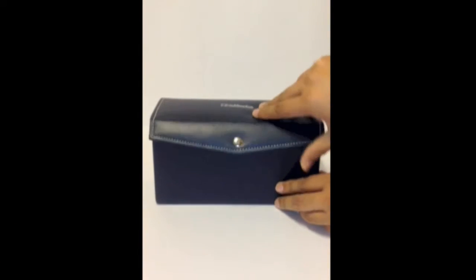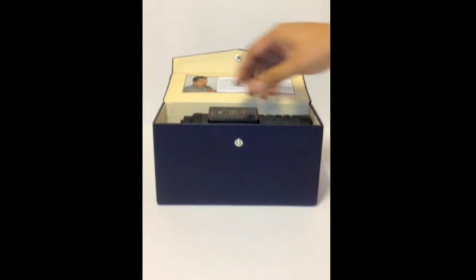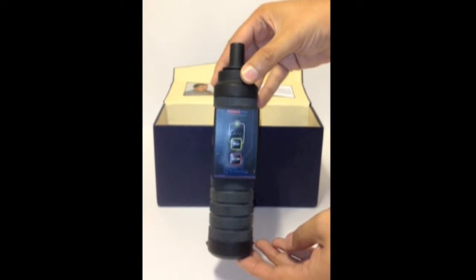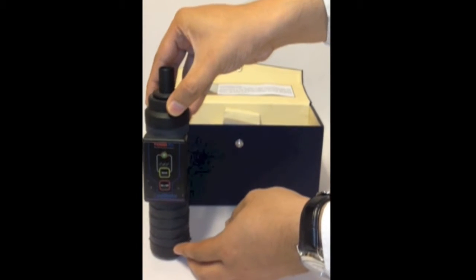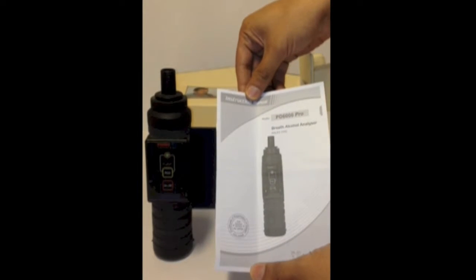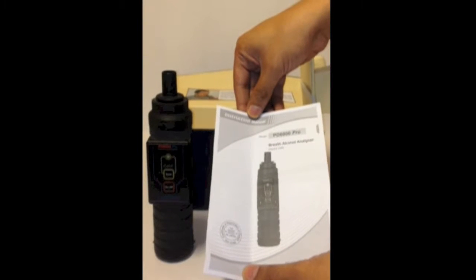PD6000 Pro is basically packed in a compact box. It contains the main instrument, the PD6000 Pro. On unveiling the package, you can see there is an operation instruction manual which deeply describes the whole operation of the instrument, which we will now demonstrate to you.